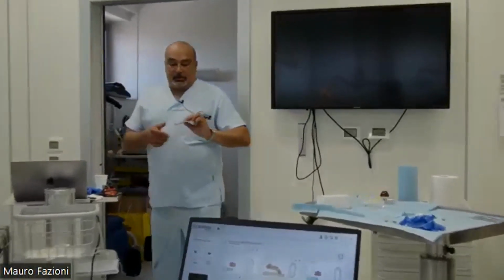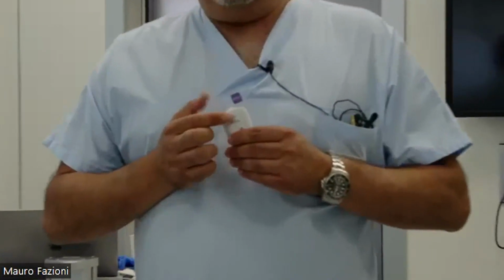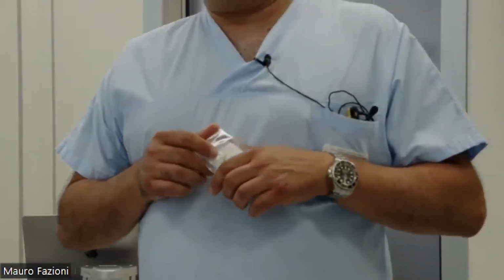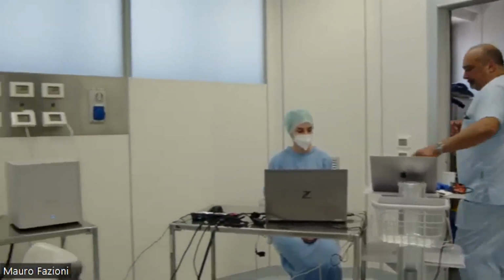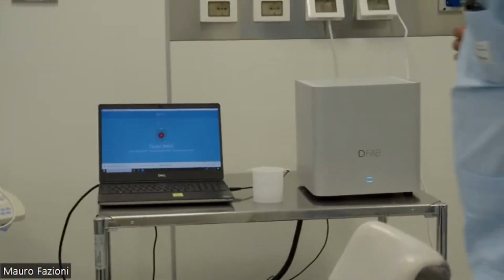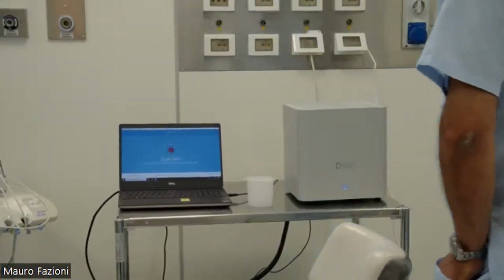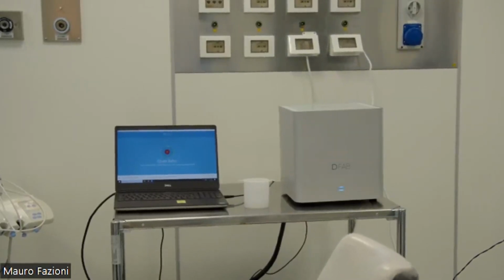This is the mesostructure where we can glue the tooth from the 3D printer into the metal structure. Okay. Few seconds. If you have any question, please, now is the right time.